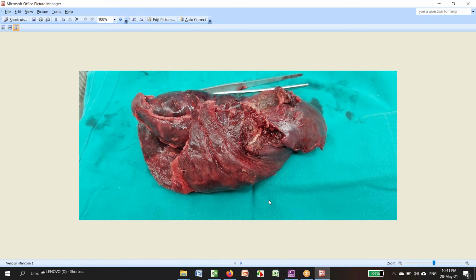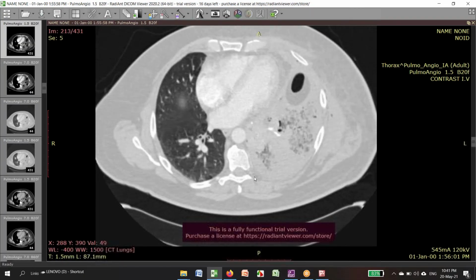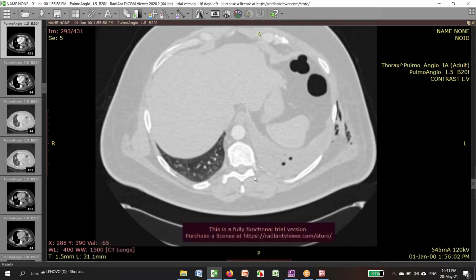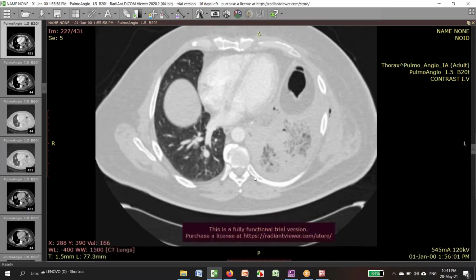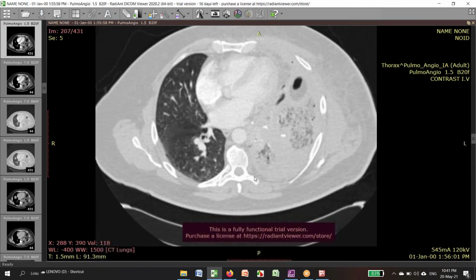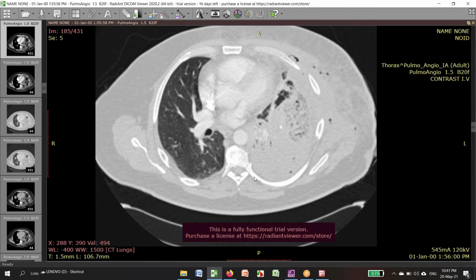Yeah, and I think your point about the bird's nest appearance is a good one. Those venous infarcts look like the giant infarcts you see with pulmonary emboli. David, do you think what we're seeing with some of the mucor is infarction as well? Yeah, sometimes we see it with mucor, and I suspect because of the angioinvasion with mucor and aspergillosis.